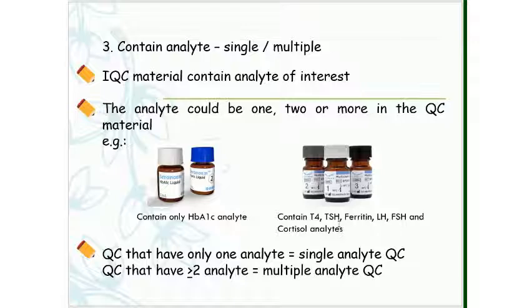Some QC are made as single analyte due to the stability of the analyte. If the analyte of interest is mixed with another analyte, there could be a reaction that can deteriorate the analyte of interest. Therefore, it is made as single.